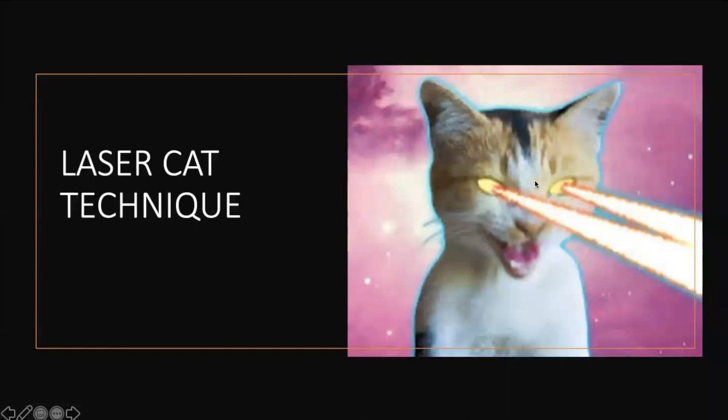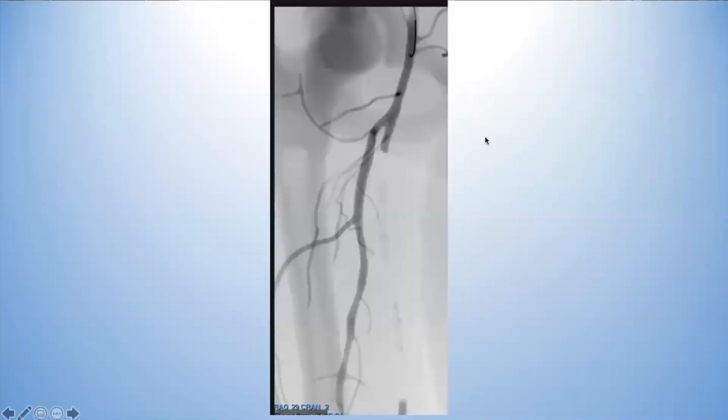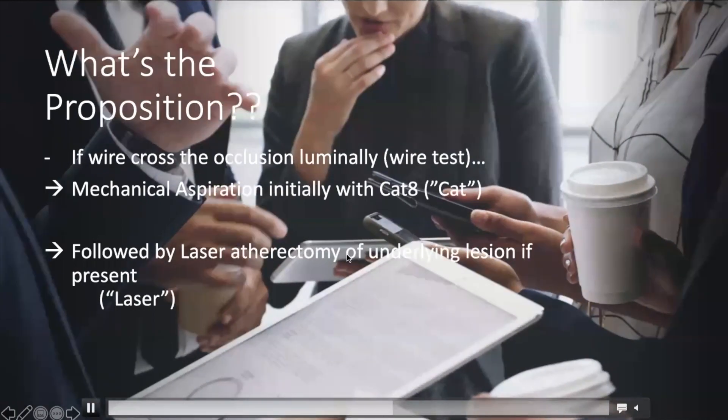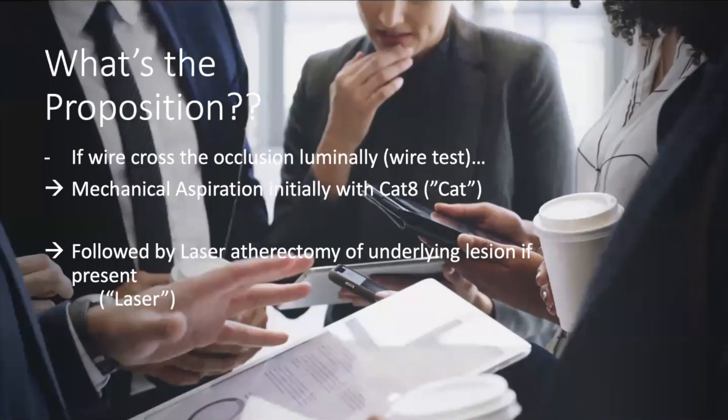There's a laser CAT technique we're writing up with colleagues around the country. Whether you have an acute limb or not, when you see a long CTO, a lot of times there's clot within it — it's not all calcified rock the entire length. If your wire passes right through, you may have clot between the ends of the CTO. Now I consider aspiration right in that segment: aspirate the thrombus, then use laser atherectomy and balloon or stent whatever short disease remains.